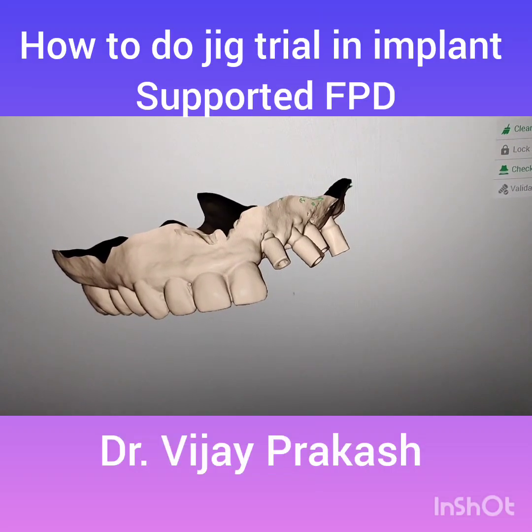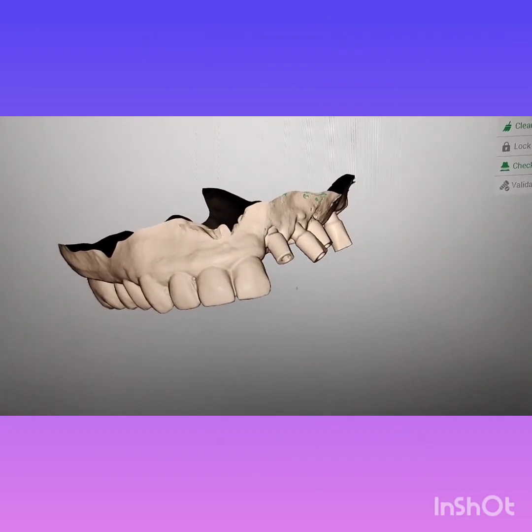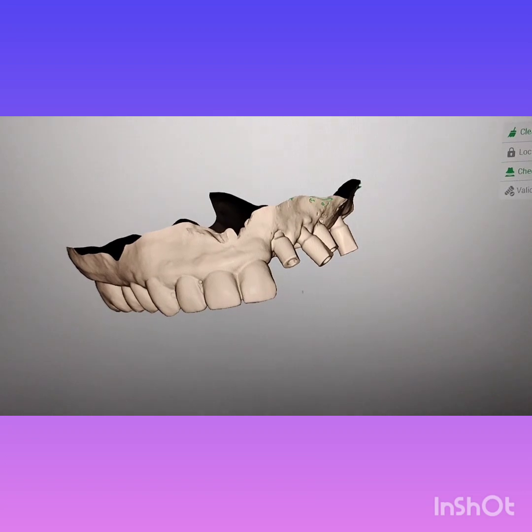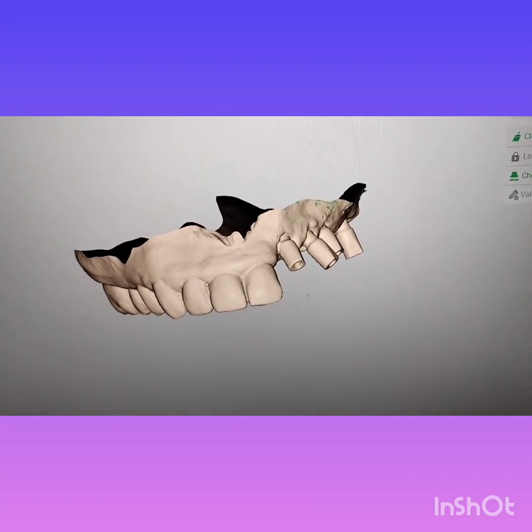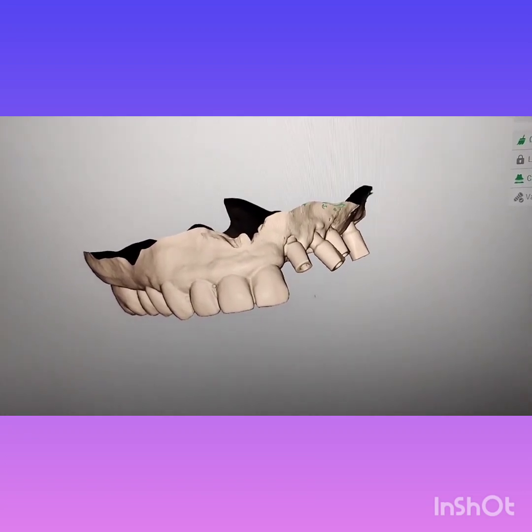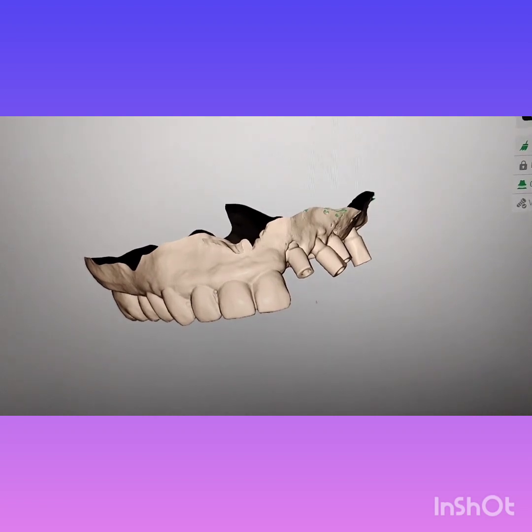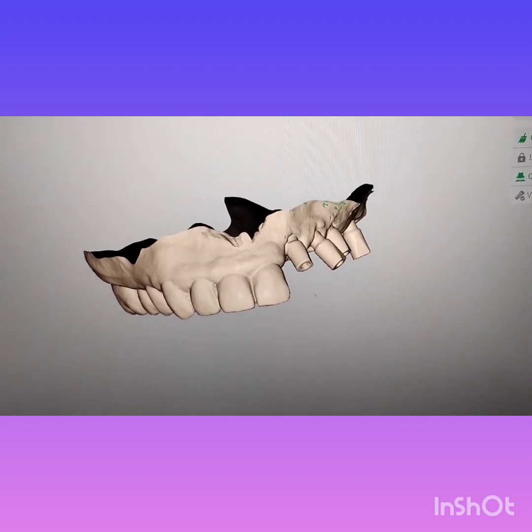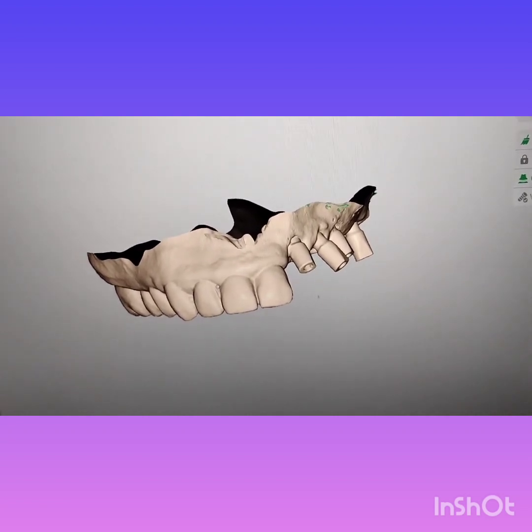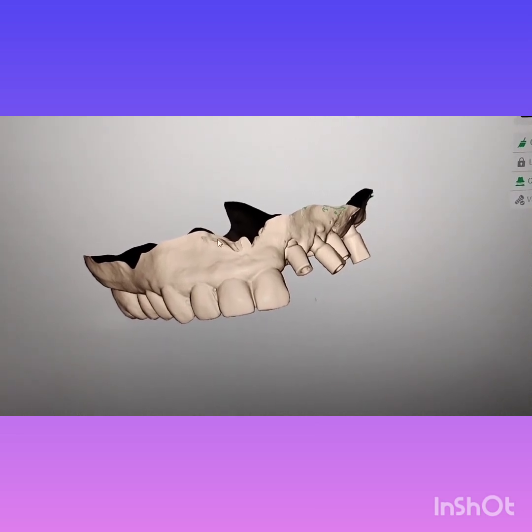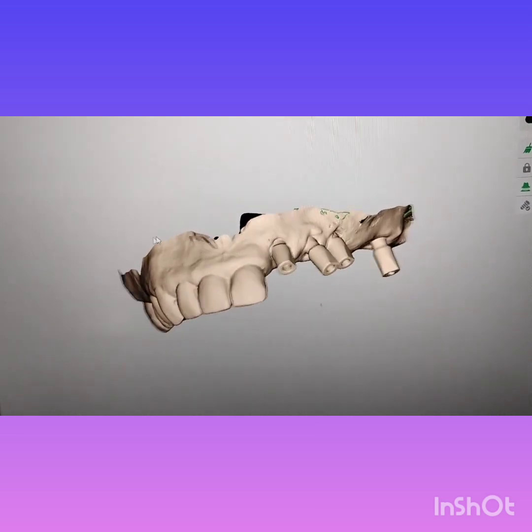Hello friends, I'm Dr. Vijay Prakash, and today I will tell you how to do a JIG trial in implant-supported fixed partial denture cases. Here we have a patient where four implants have been placed in this segment, as you can see.